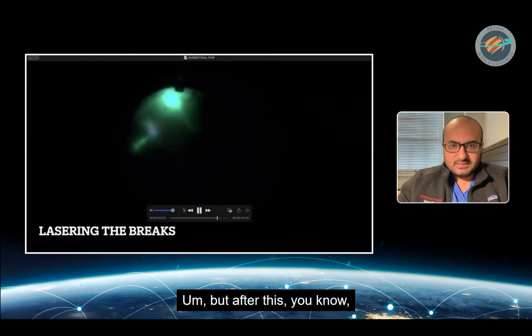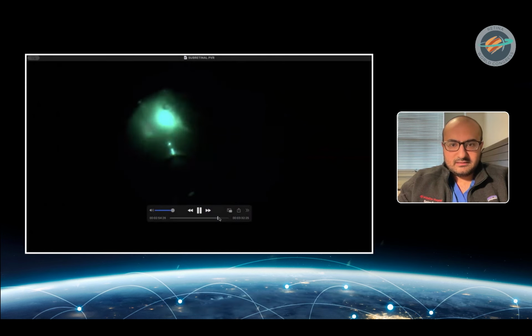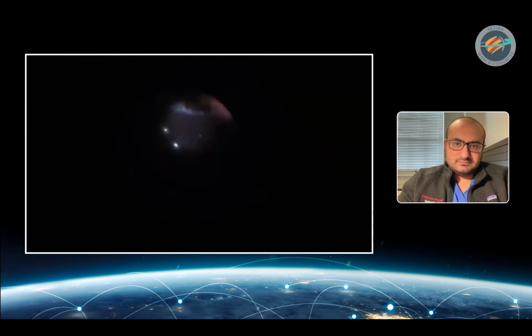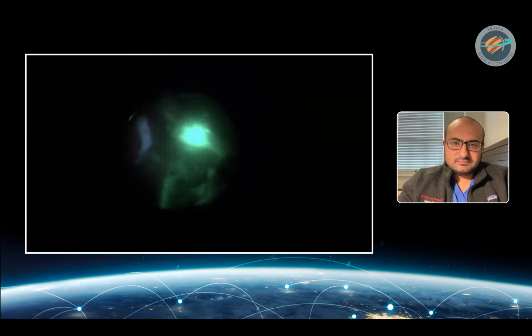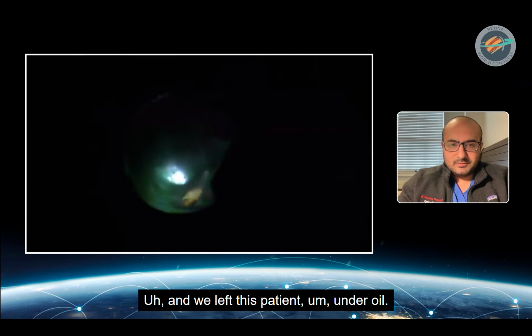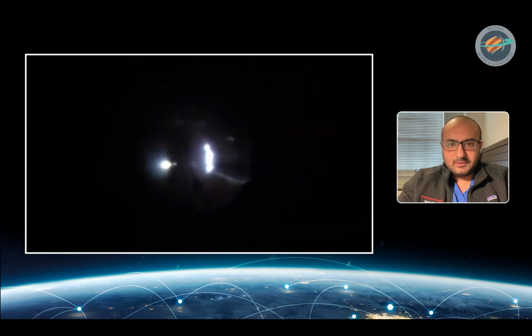But after this, the retina was able to be flattened. And we left this patient under oil.